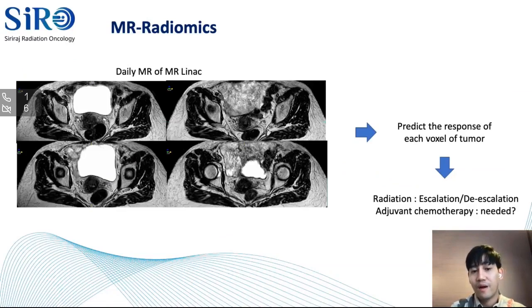Because we have daily MR images, right? If we know that some features or some shifts are significantly correlated with the tumor response or clinical outcome, it can help us identify the patients who should receive escalated therapy, like more dose or more adjuvant chemo, instead of observation after concurrent chemoradiation. Or if the patient is low risk, so we are quite sure that we can observe, we don't need to give any escalated dose or more adjuvant chemotherapy. So it can help us personalize treatment for the patient.